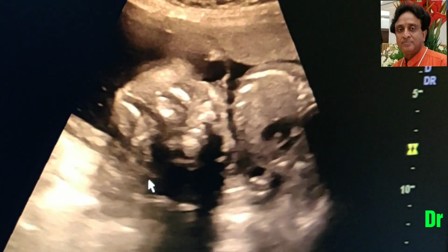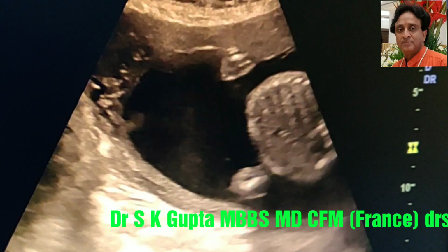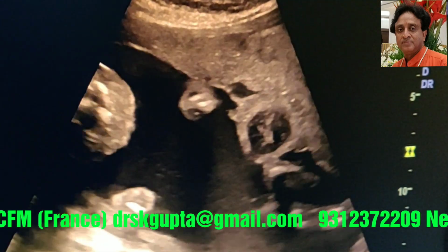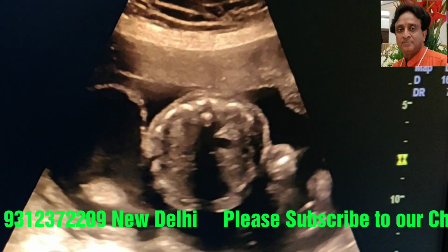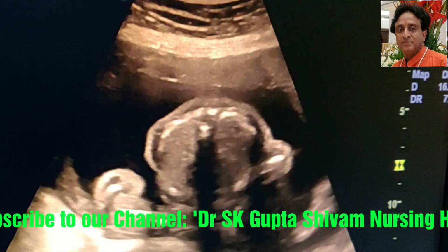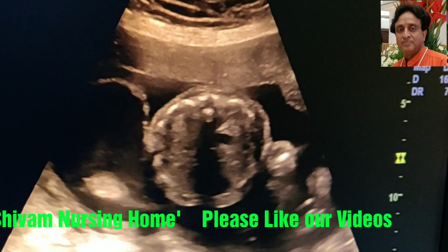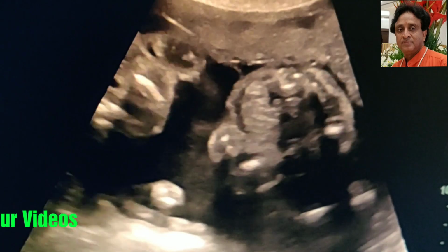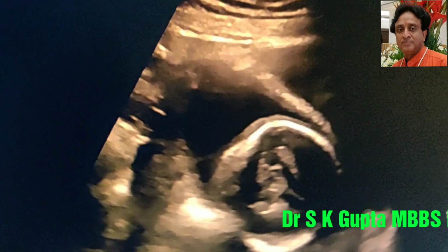But here in our case there was no polyhydramnios, and when we tried to measure the AFI in the anencephalic fetus, we found that the AFI was around 21.5, and while in the normal fetus the AFI was around 18.5, though within the normal range. But as the time may advance, the anencephalic fetus may have polyhydramnios, and this polyhydramnios may induce early preterm labor. Though only one fetus is suffering from anencephaly, the prognosis of both the fetuses is poor.